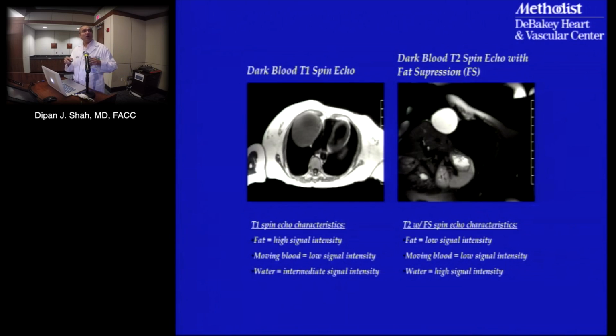If I do T1 weighted imaging, then anything that has slow T1 recovery will appear dark. Anything that has fast T1 recovery, like fat, remember we said fat has very fast T1 recovery, will appear bright. Now on the flip side, that same cyst, if I do it using a T2 weighted pulse sequence, and again with the T2 for water is long or short?